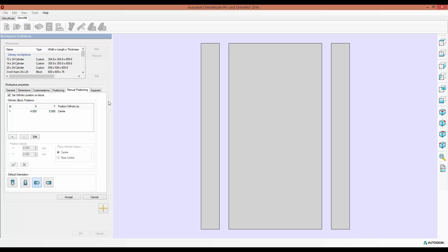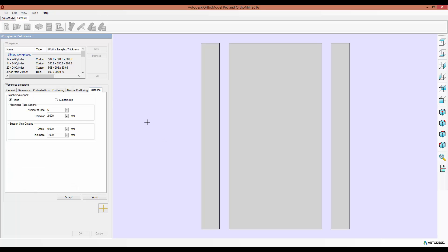Now the Support section allows you to set the default tabs or support strip options. So you can switch between which one is used, set the number of tabs, the size of them, the thickness of the support strip, etc.